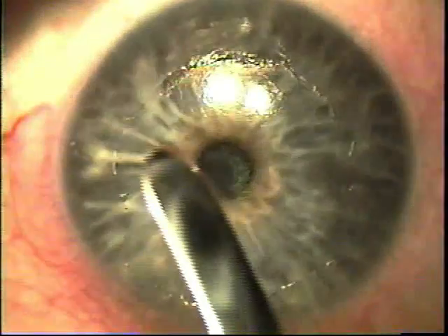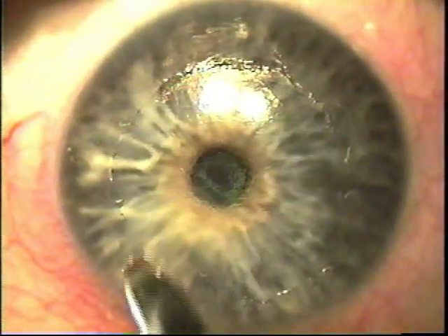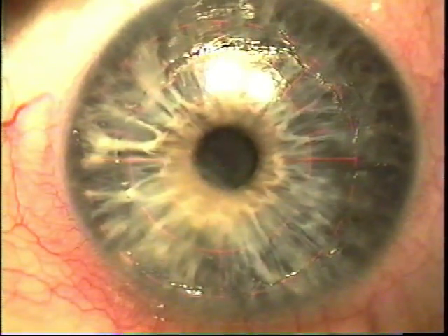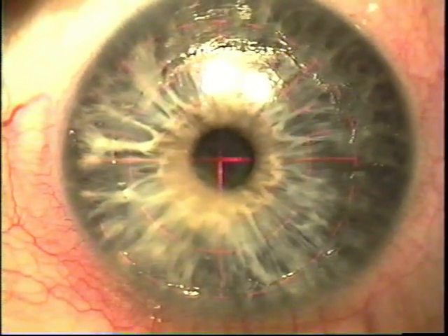Notice that despite the smoothness, the opacity remains in its area — but that doesn't matter. You will proceed with the refractive ablation at this point.